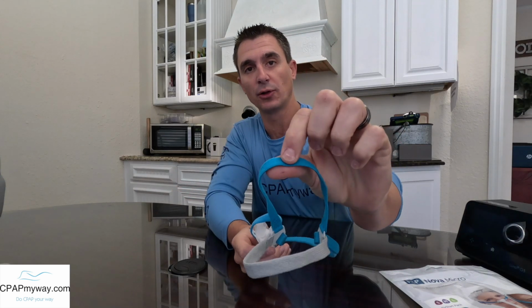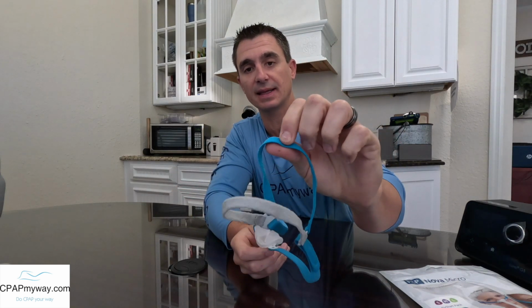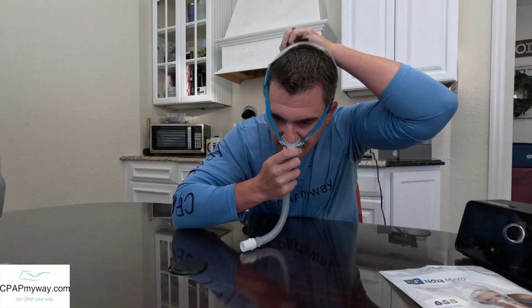So I don't think that quick disconnects are very relevant in situations where you've got such a simple mask as this. All right, so what I want to do here is show you how I would fit this mask, and we'll run it with a little bit of pressure here and you'll get an idea of what it sounds like. All right, so first thing you want to do is get a hold of the blue strap. Remember I said the blue strap goes to the back of the head, gray strap goes to the top of the head. And with these masks, I recommend pulling the headgear right in front so that you're kind of exposing the nasal pillow there and it's ready to rock and roll. What you'll do is just fit that right into the nose. I always give it a little wiggle so that it goes into my nostrils. And then I grab that blue strap, pull it straight over the back of the head.